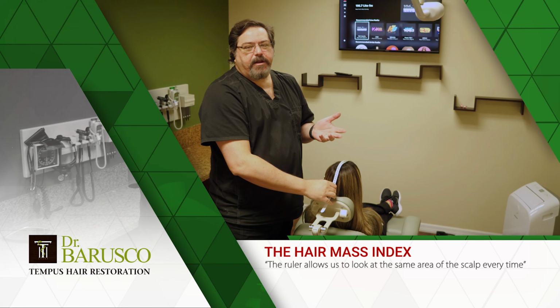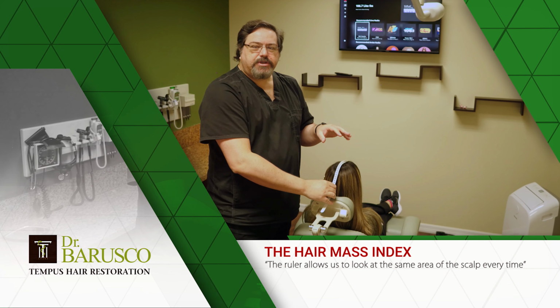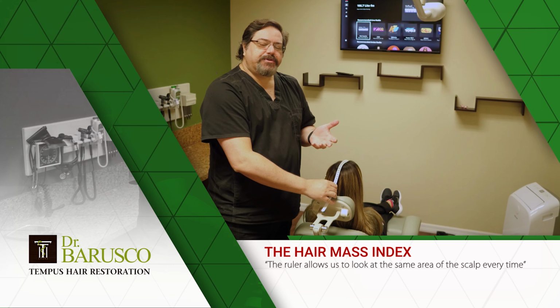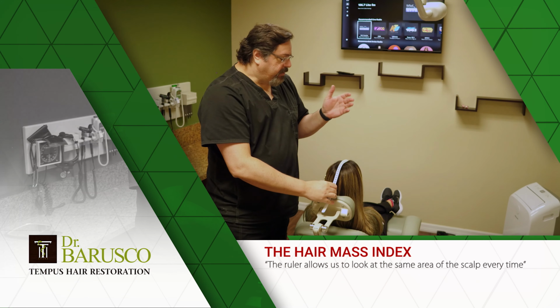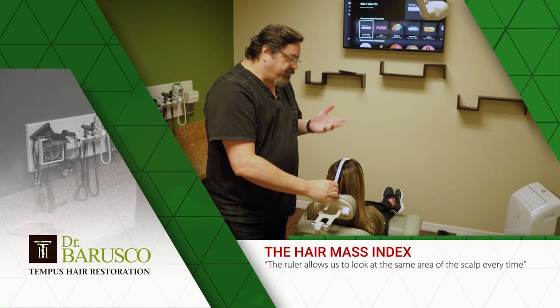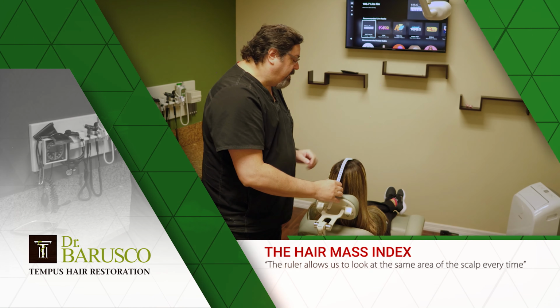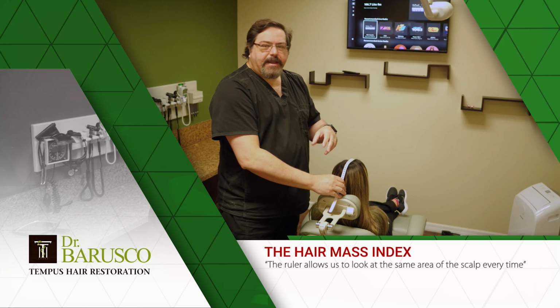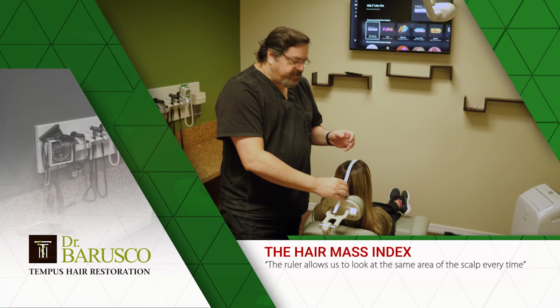As I said before, the hair mass index is a good parameter to gauge current hair loss, where you are at the time of the consultation, and also progression of treatment and success of treatment too. So getting a baseline is what we do with this. So we measure an area. I've already taken the liberty of doing that out of the video so we can save some time. So I choose the area where there's some thinning on the top. I pick up that spot or more than one sometimes.